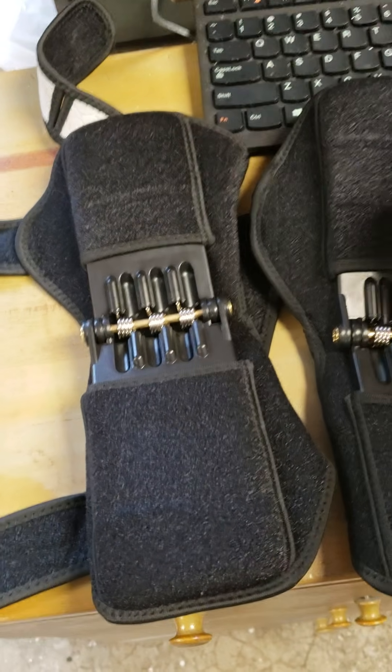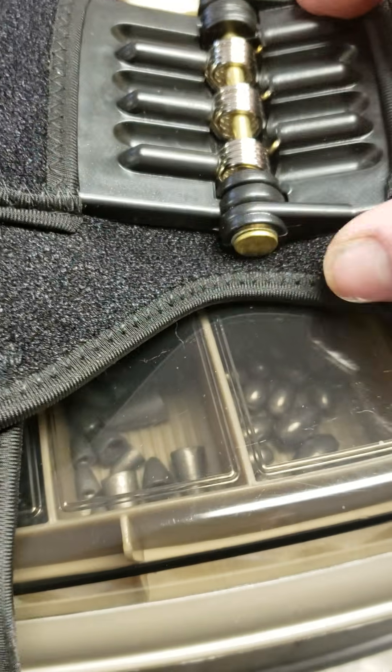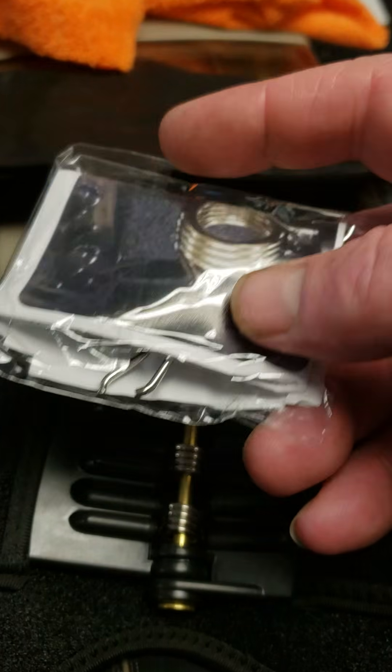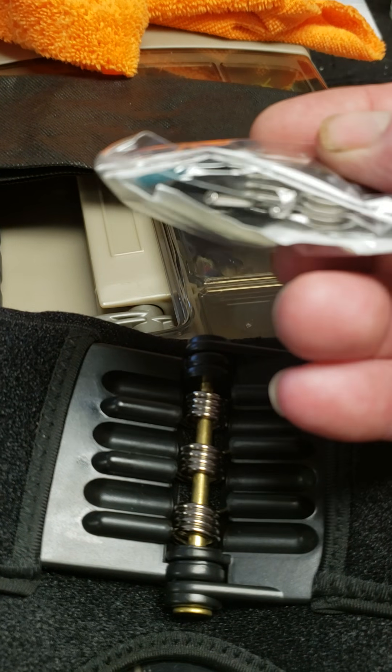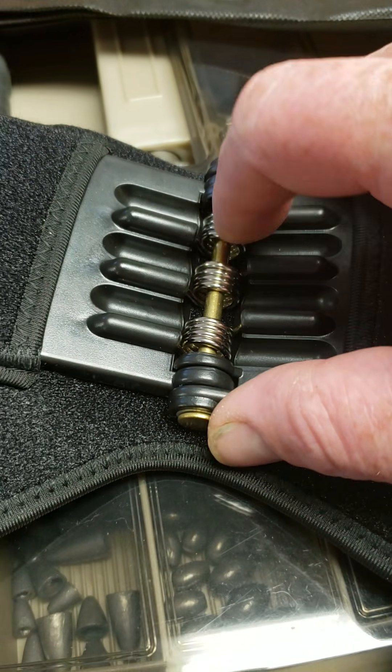So I got these, and all of this here is ABS plastic — which, that's not bad. ABS is pretty good. It does come with a package here with some more springs, because I'm imagining these springs break.